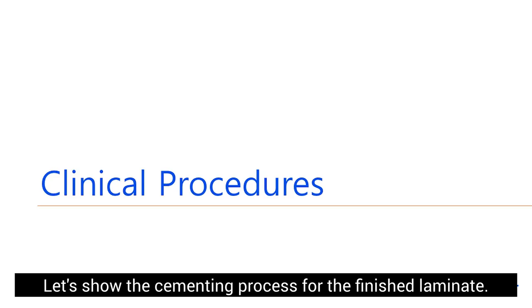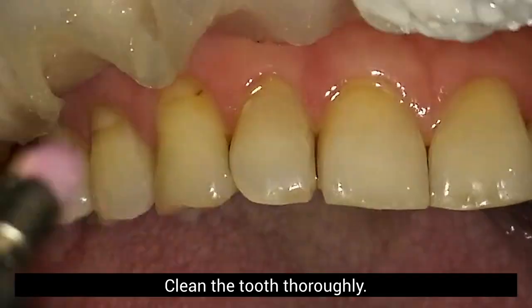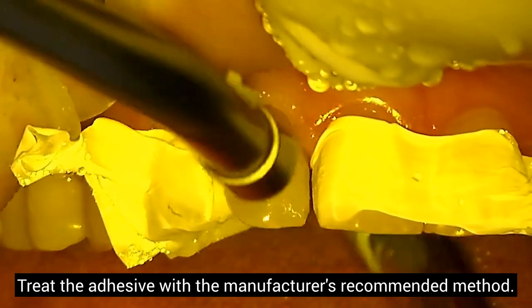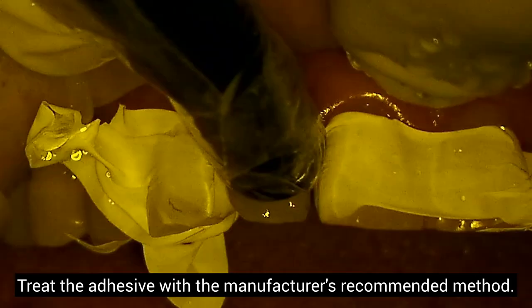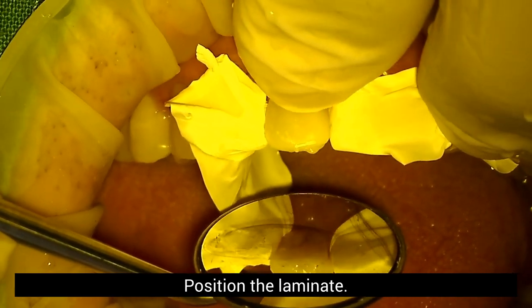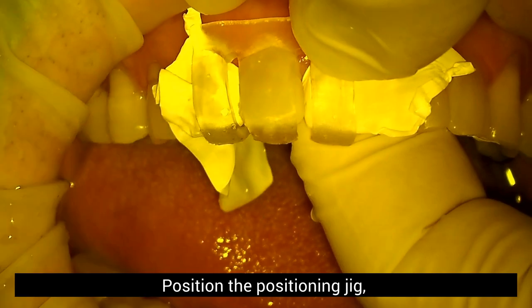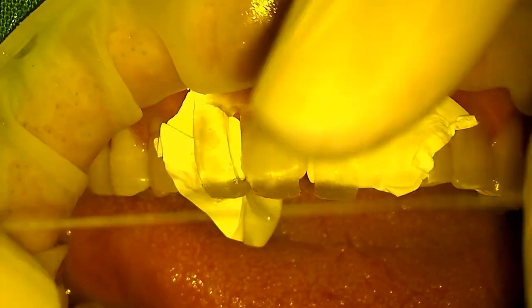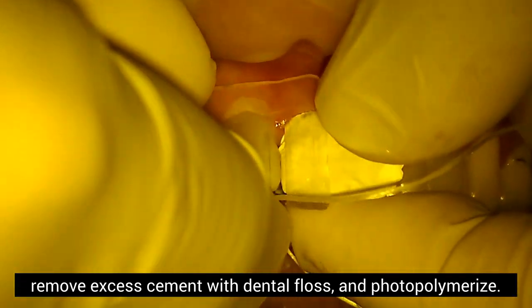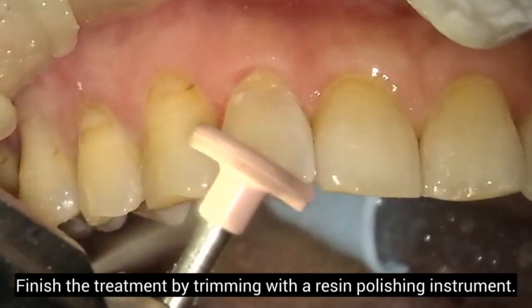Let's show the cementing process of the finished laminate. Clean the tooth thoroughly. Etch, wash, and dry in that order. Treat the adhesive with the manufacturer's recommended method. Apply the flowable resin to the inside of the laminate as a cement. Position the laminate and the positioning jig, then remove excess cement with dental floss and photo-polymerize. Finish the treatment by trimming with a resin polishing instrument.